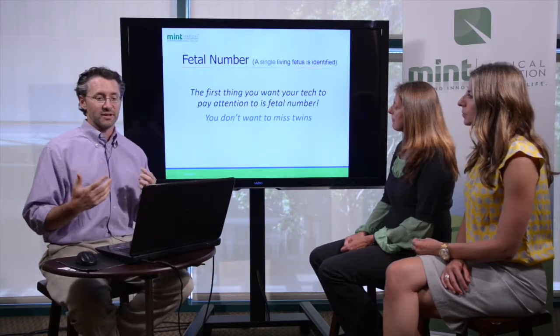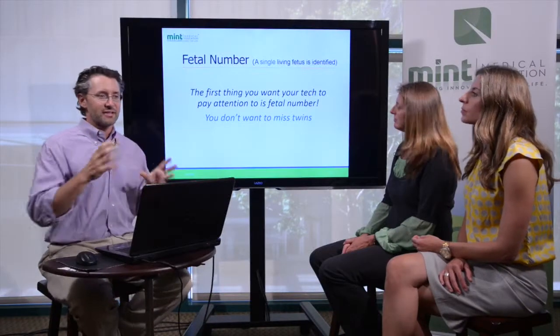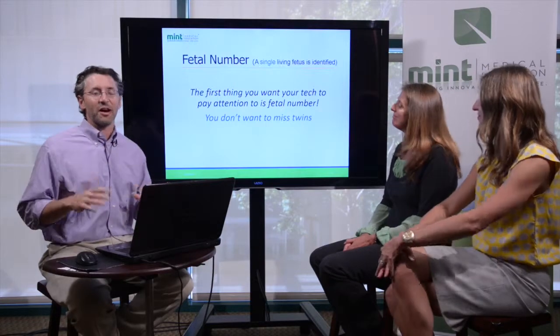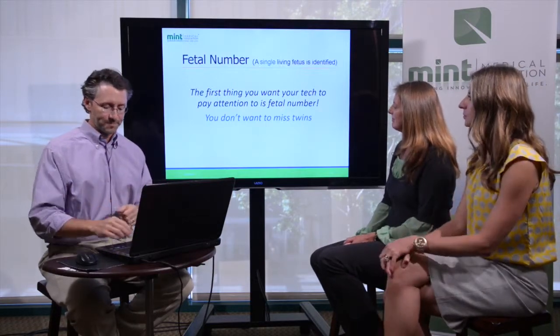The way someone taught this to me once, which I still use to this day, is that if you were asked to walk into a room and count how many people are in there, and your life depended on it, what would you do? Would you walk in the room, peek in and say, oh, I think there's about 2 people, and walk out? No. You would walk in, look under every bed, look under every desk, look behind the door, make sure you count. Same thing, you want to look around every corner of that uterus, count them up, and figure out how many babies are in there.